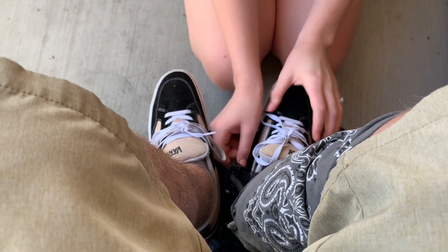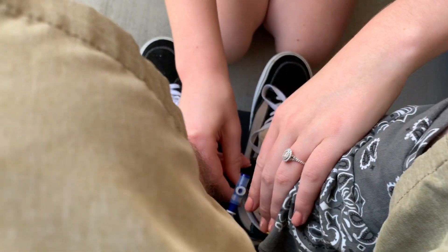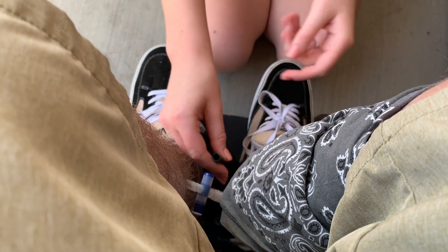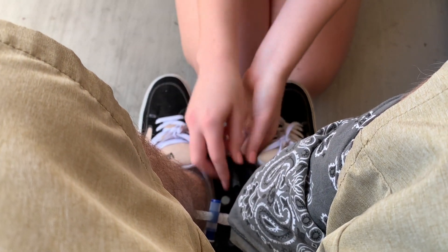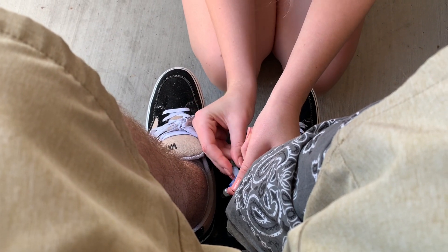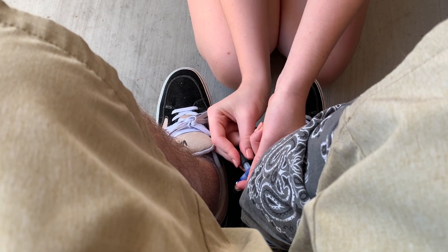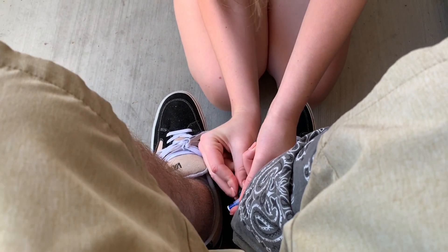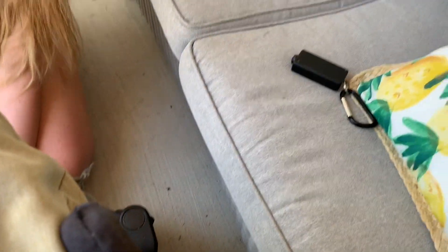She's putting the Velcro around my ankle to hold it in place. She's going to pull the tubing through the hole now, and then there's my bag — that's the end of my bag. Sometimes you have to readjust the rubber tubing. She's putting that rubber tubing on the end of my bag. Then I'll basically open my bag to release it, but it's getting pinched off by the Freedom Flow, so nothing is going to come out until I hit the button, which is right there.